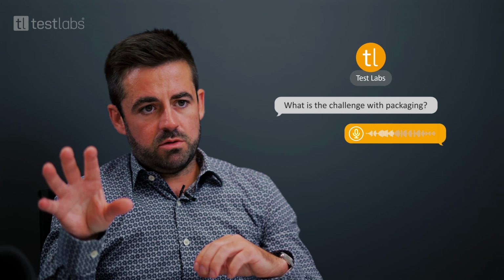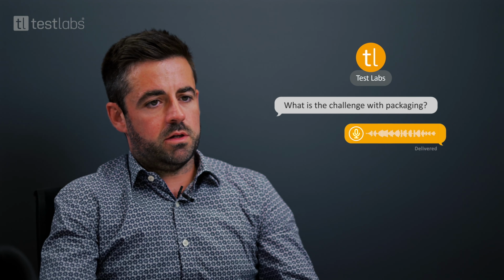So this means we do not put something inside the carton box. So let's say 10 devices in primary packaging in one carton box or in one pallet inside the sterilization chamber. This is not how we do it. We do it directly in the primary packaging, and we do the palletization of secondary packaging after. So let's say packaging is really a critical point to review for compatibility and efficacy on one hand, but also for organizational and logistic issues on the other hand.